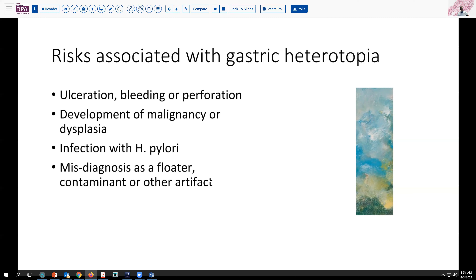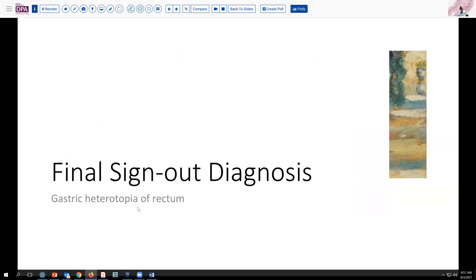In that regard, you want to make sure that ideally you see the continuity between the normal tissue of the site and the ectopic gastric mucosa, as we see in our sample with colonic mucosa at the margins. So with that, our final sign-out diagnosis is gastric heterotopia occurring in the rectum, and no further management would be needed in this particular case.